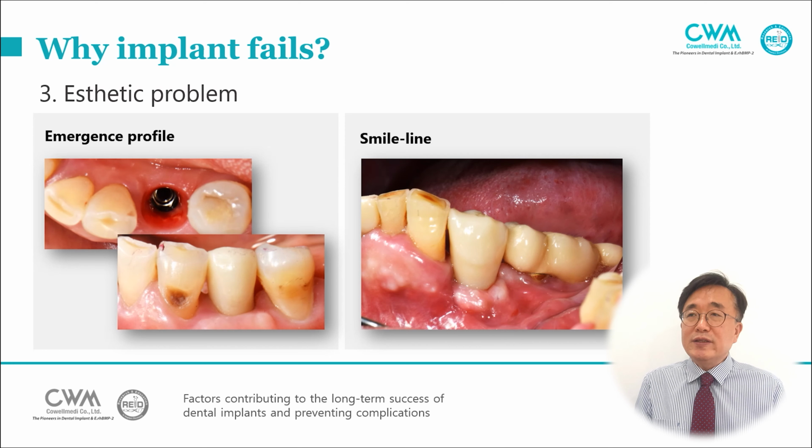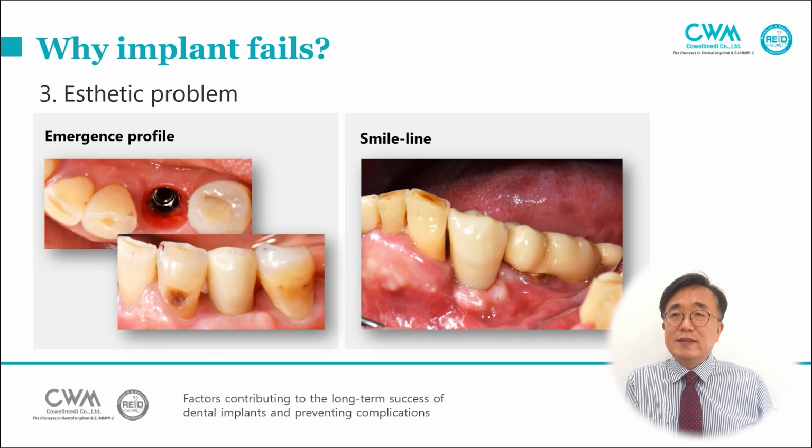And third, aesthetic problem. Emergence profile is a major factor in the cervical aesthetic appearance. And second, the smile line of the incisor edge and gingival line is important in aesthetic appearance. So we have to adjust this incisor and cervical line.